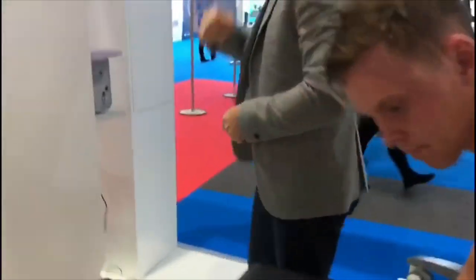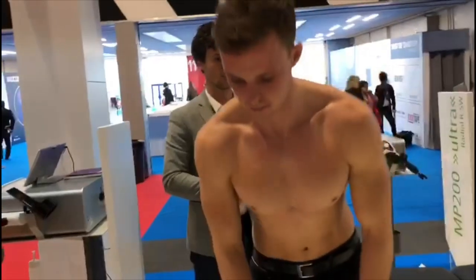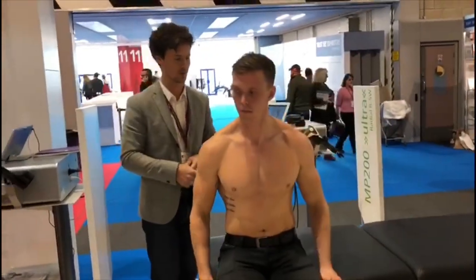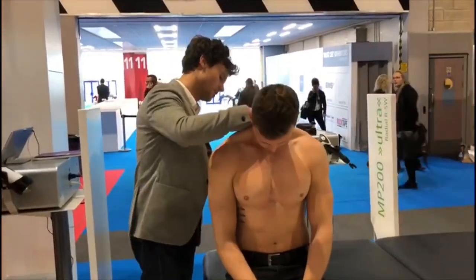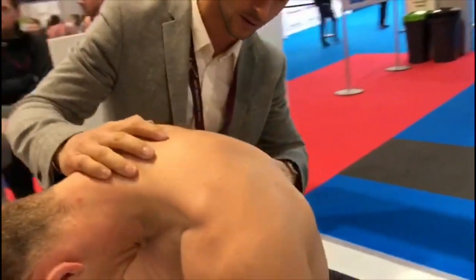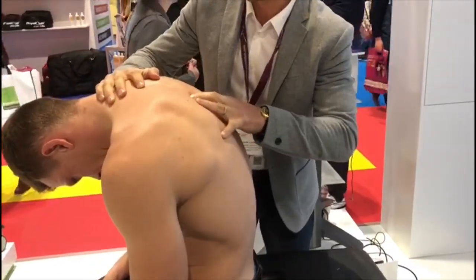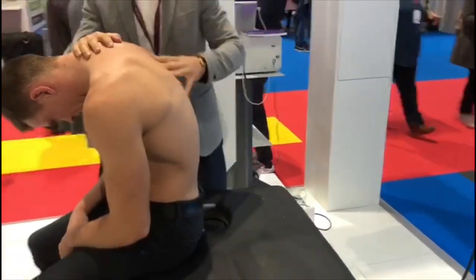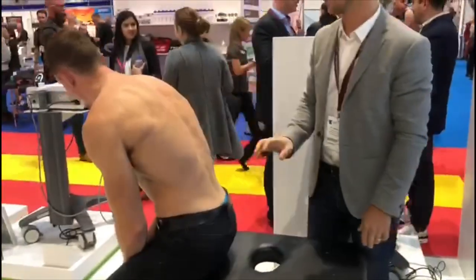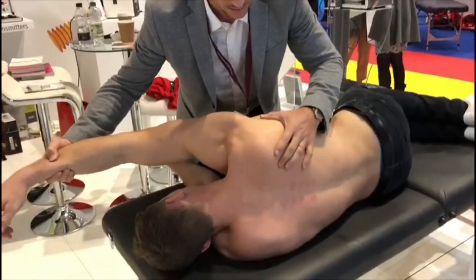Then we'll continue with the fascia applicator, which will probably generate another part of the movement, right? Okay, a little bit better actually. Okay, now we're going to continue with the fascia. So what happens if I passively do like this?